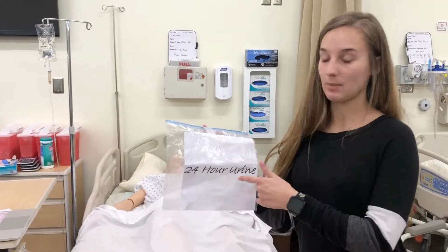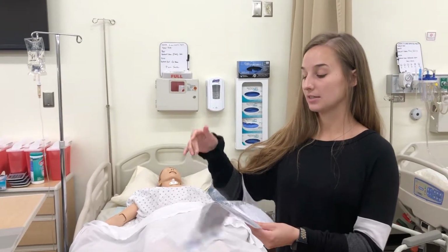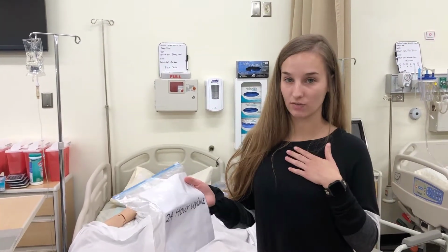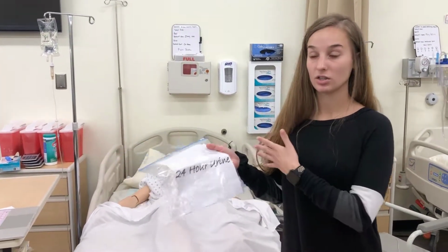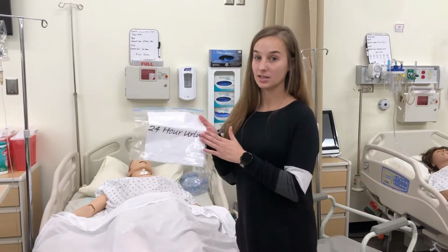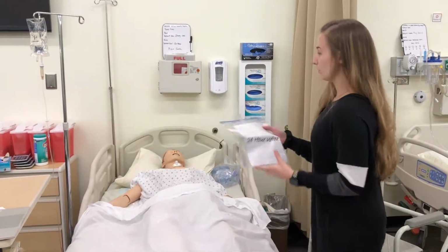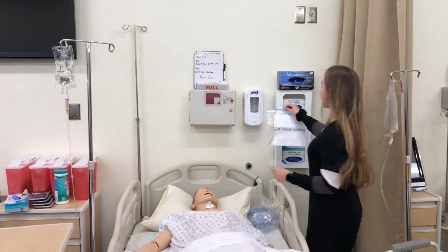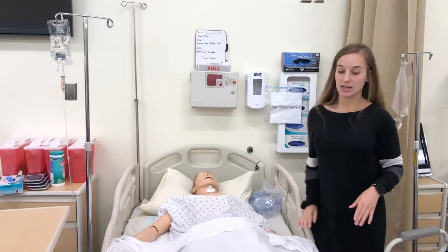start date and time and the end date and time on the patient's bathroom door, because if someone else besides yourself as the RN, like the nursing assistant, is bringing your patient to the bathroom, then you're going to want them to see this and know that they need to adhere to the test. So you put this on the patient's door or the bathroom door just as a reminder.